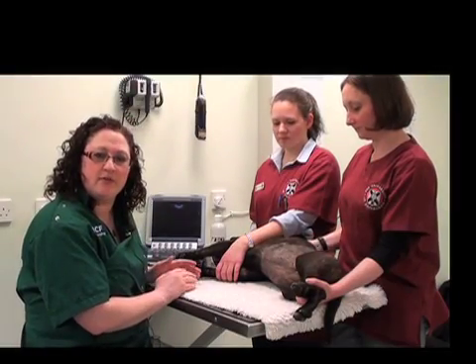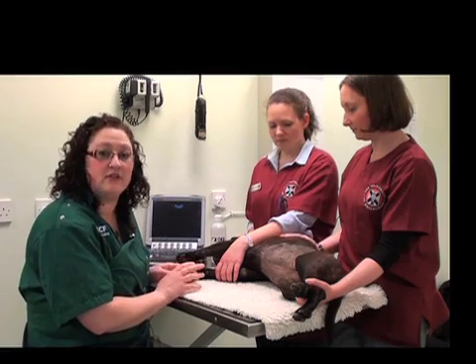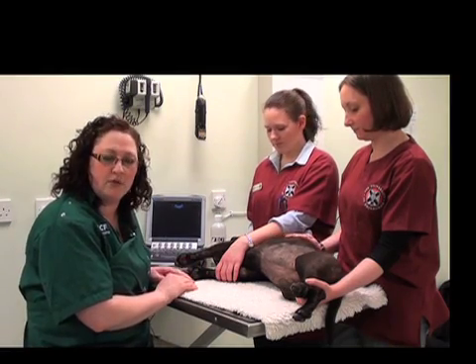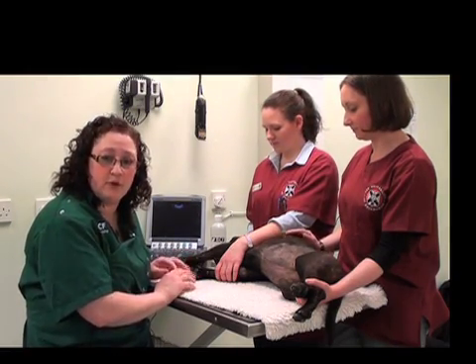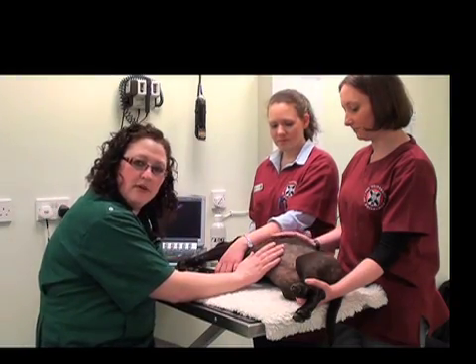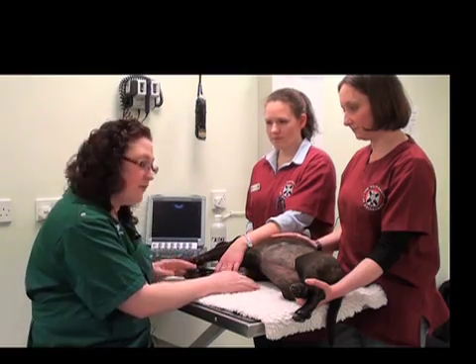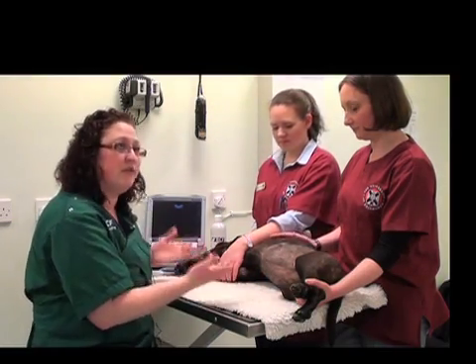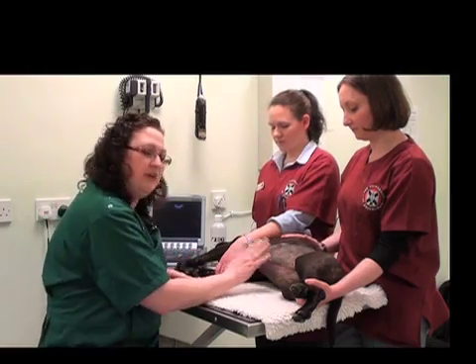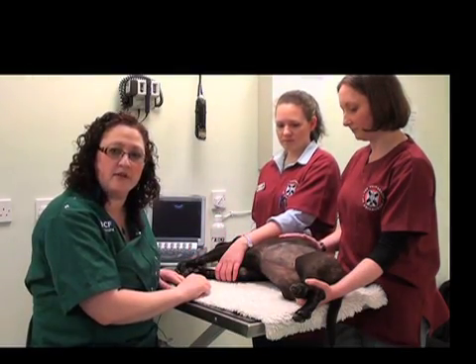It's very important when performing an abdominal ultrasound examination that you really take care to make sure your patient is as comfortable as possible. It will really help to make your exam process a lot easier. So the first thing you want to do is make sure that the room you've chosen to perform your examination in, whether that's a dedicated room or a consult room such as this, has not a lot of traffic going through it while you're performing your exam.